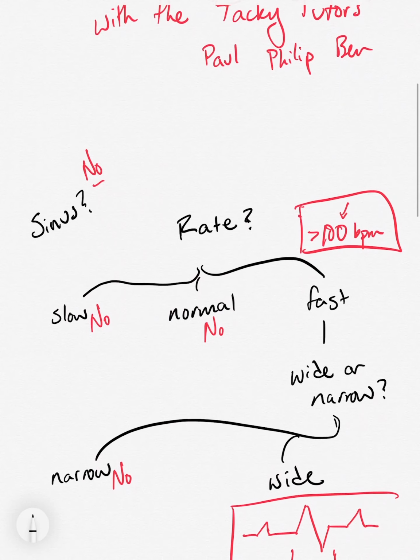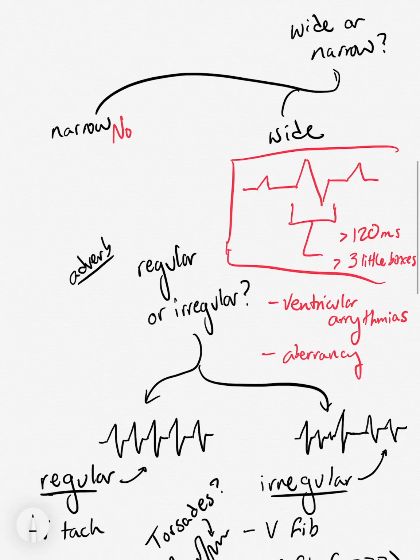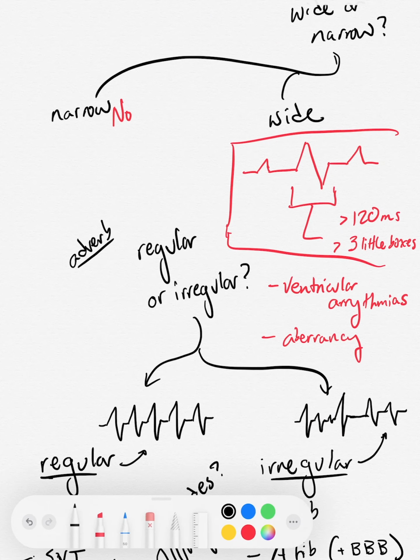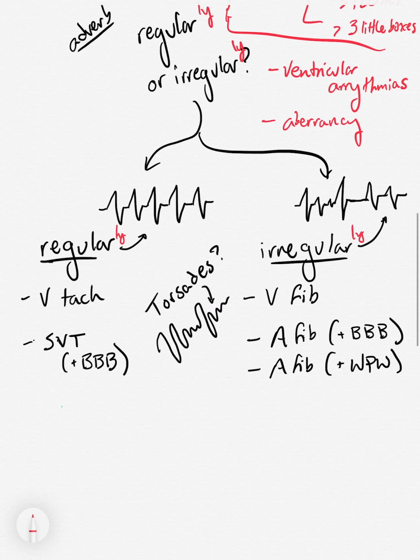Up here, when we asked is it sinus or not, is when we agreed that this is the adjective irregular, that second word, the adjective. So we are only asking ourselves down here on our tree about the adverb, regularly or irregularly irregular. These are all adverbs. Great, talking about spacing.